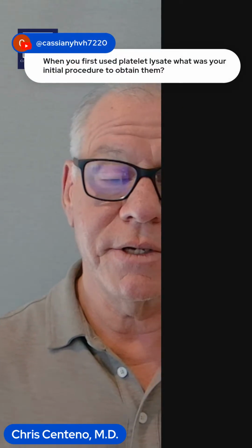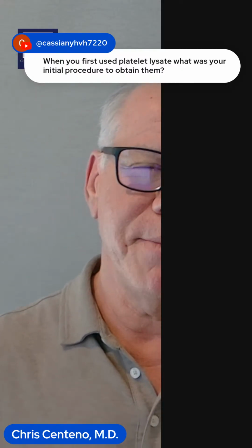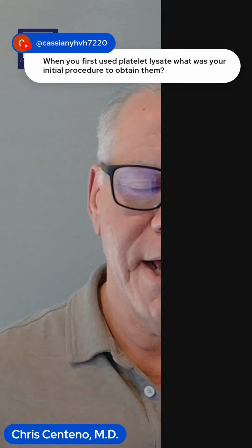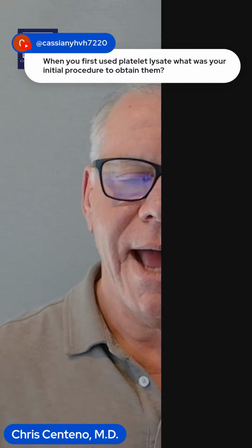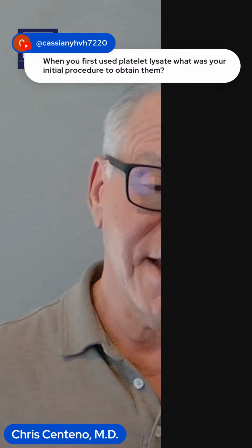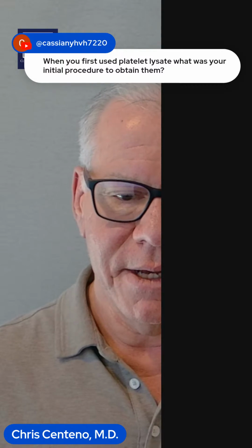Casey, when you first used platelet lysate, what was your initial procedure to obtain platelet lysate? The initial procedure was just an overnight freeze and then a thaw. As time went on, we figured out that you could markedly increase the growth factor levels by making it in different ways. So we ended up doing that.